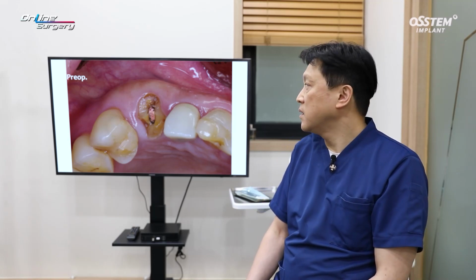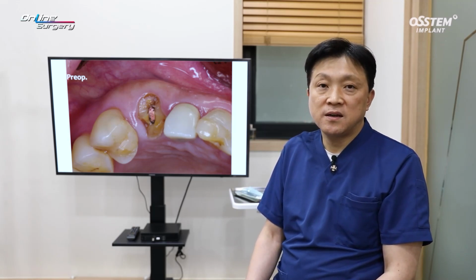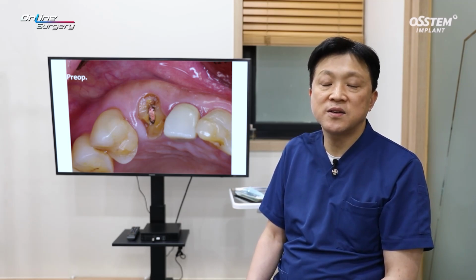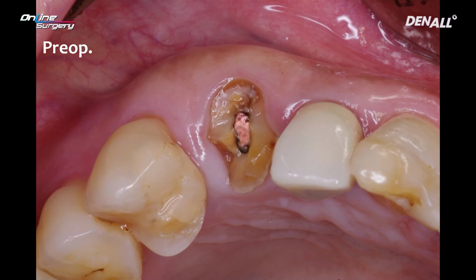Today, I want to share with you a case in online surgery lecture. In number 13, there was crown root fracture requiring immediate implant placement. If you look at the intraoral image pre-op, the patient received the crown before and the crown was fractured.